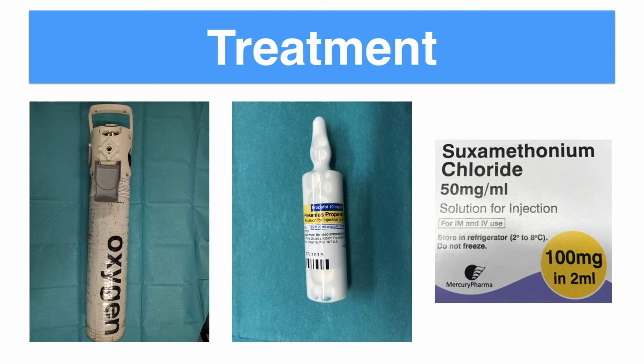Hang on, what's going on here? Why are these cords closed? Why can't I pass the tube? What do I do? You need to know about it and have thought about in advance how you're going to deal with it. So like I say, there's really only two circumstances I can imagine this occurring when dealing with critically ill children and babies.